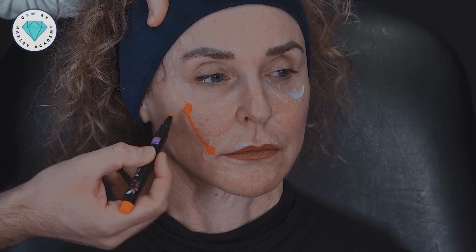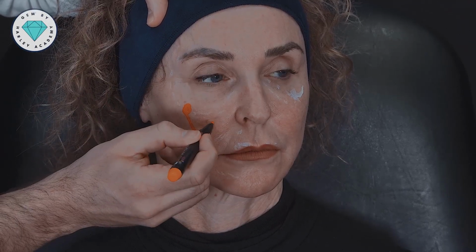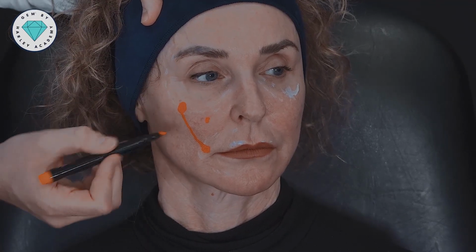Biomechanically, when the patient smiles and this muscle contracts, it will bunch filler medially, and so it will create anterior projection in this part of the cheek. This has recently been described as the transverse facial septum. We have to be very careful in this medial cheek compartment to avoid overfilling, because at rest things can look beautiful and harmonious, but upon smiling we can create too much anterior projection, which starts to look unnatural.